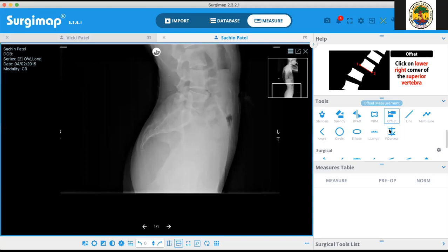So to have consistency, I probably did it that way. And I think more than the main thoracic kyphosis, you are measuring the proximal thoracic and the junctional areas, giving some importance to them. Yeah, I think that is more reliable, as Kshitij said, no? It's from end vertebra to end vertebra. And if we have a particular kyphosis or hypokyphosis, say in the junctional area, the DL junction, then that should be counted.